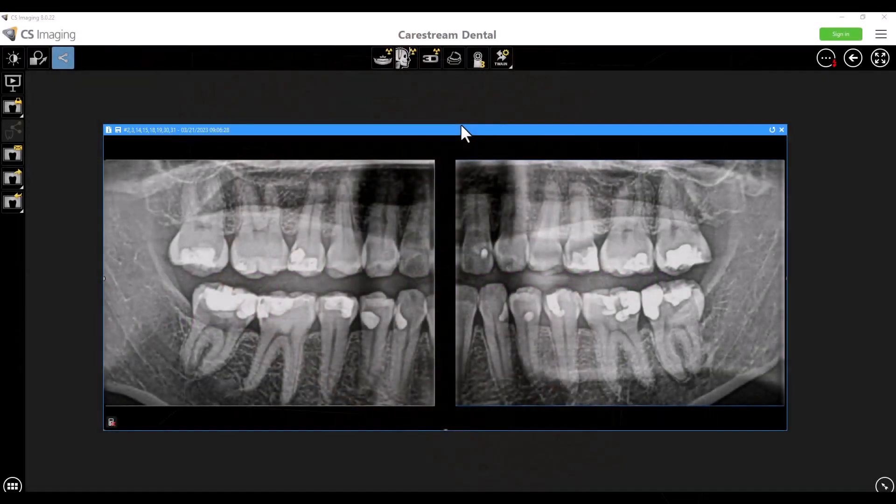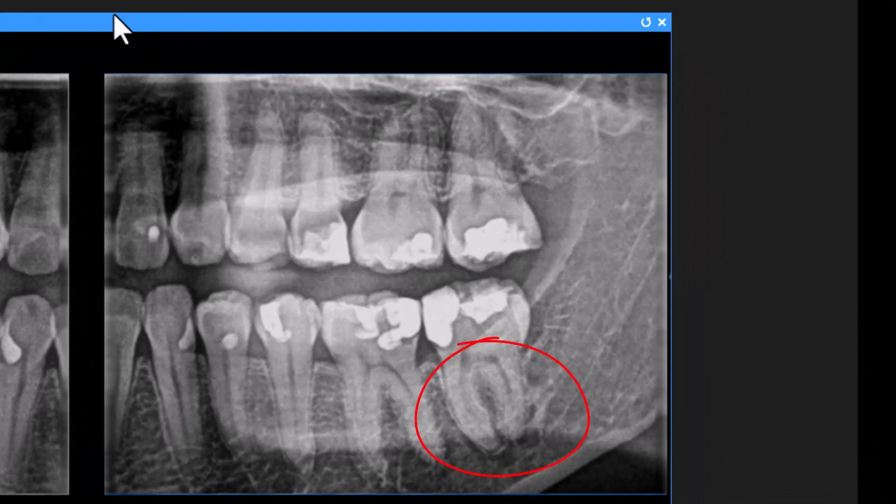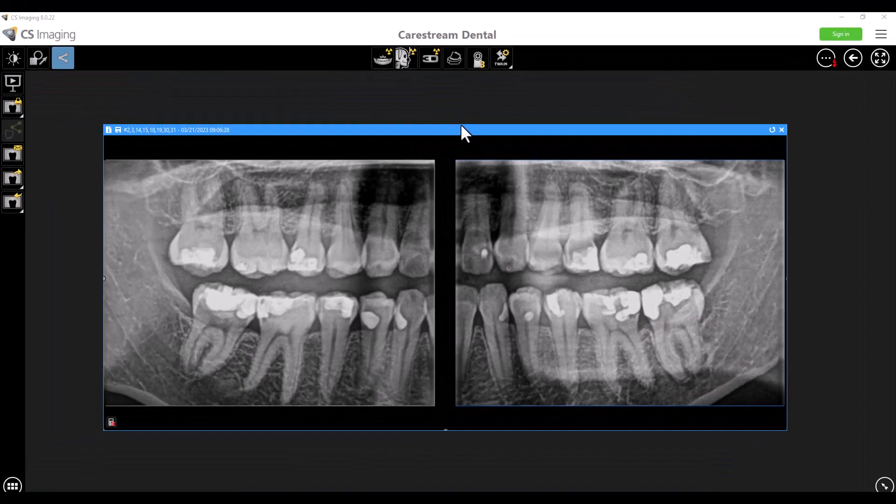So this is an extra-oral bitewing that I took on a doctor not that long ago, actually during a training session. The doctor, after reviewing the bitewing, was a wee bit concerned about what's happening at the apex of number 18 mesial and distal roots. She was going on vacation within the next four or five days and was super concerned it was going to flare up and ruin her vacation. It was asymptomatic and no clinical testing had been done just yet.